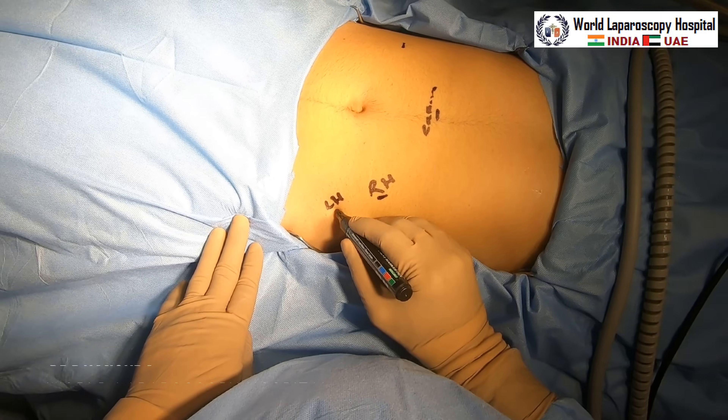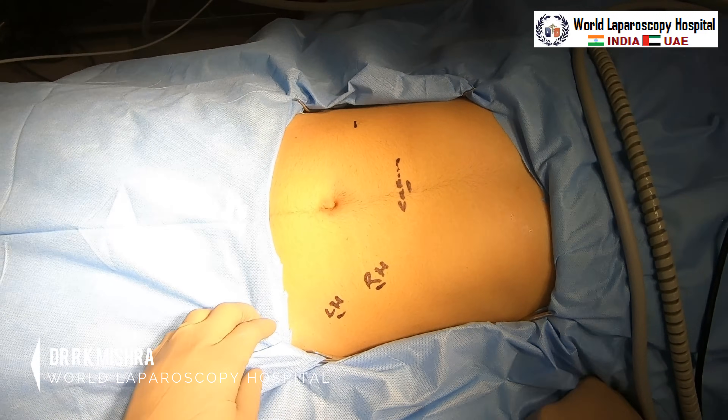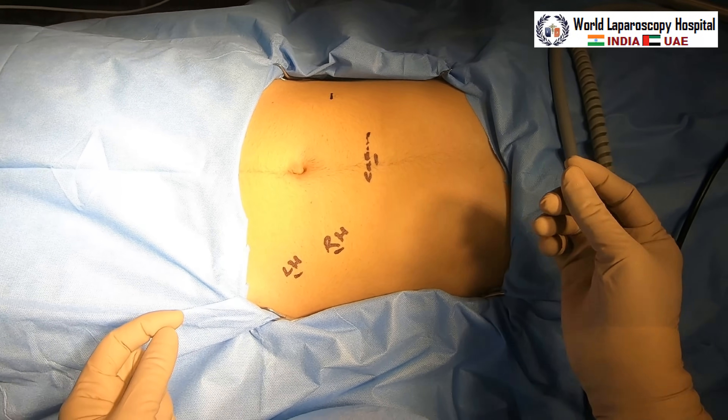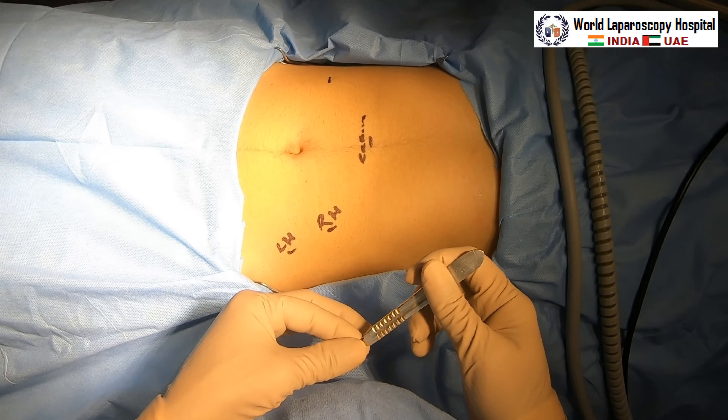We will use the Veress needle technique. Although open technique may be performed, open technique takes a little more time. In this situation, because it's an emergency, you can use the Veress needle technique — just a small stab wound will be given.